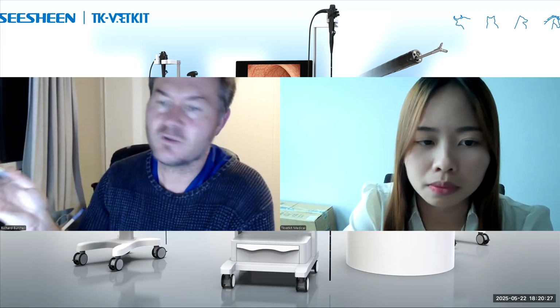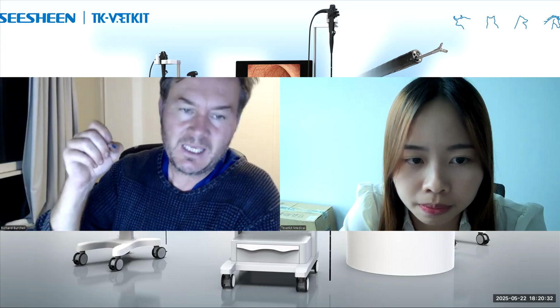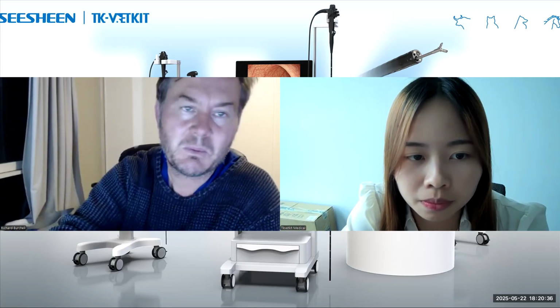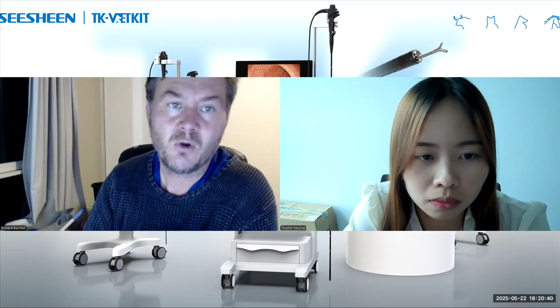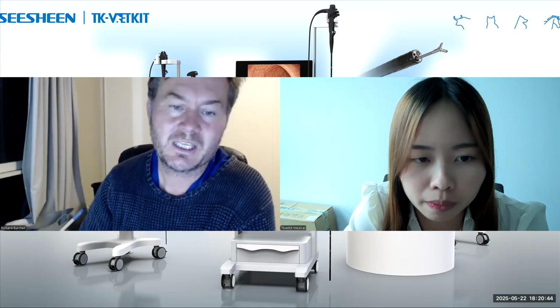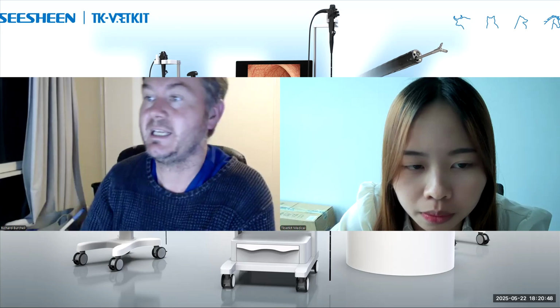How you do that doesn't really make a big difference. Whether you look at the proximal trachea first and then intubate them and then go deeper into the airway, it's really up to you. I think the principle is just to know that if you've only scoped through the ET tube, you haven't seen the whole trachea, particularly if you've fed it all the way down to the thoracic inlet.